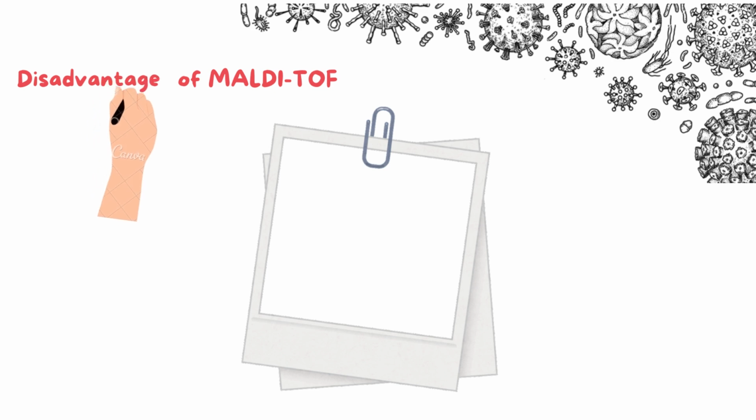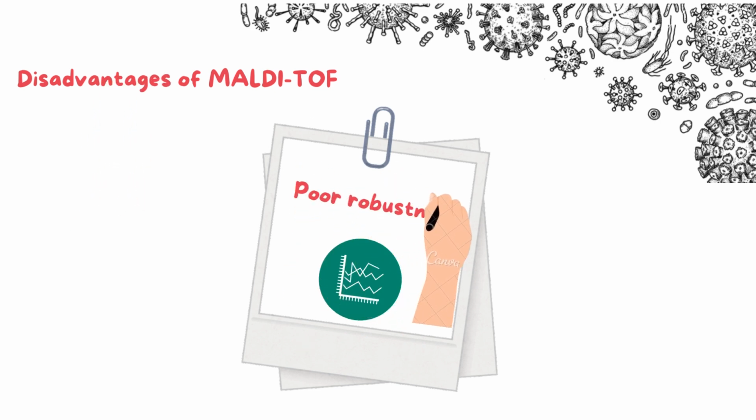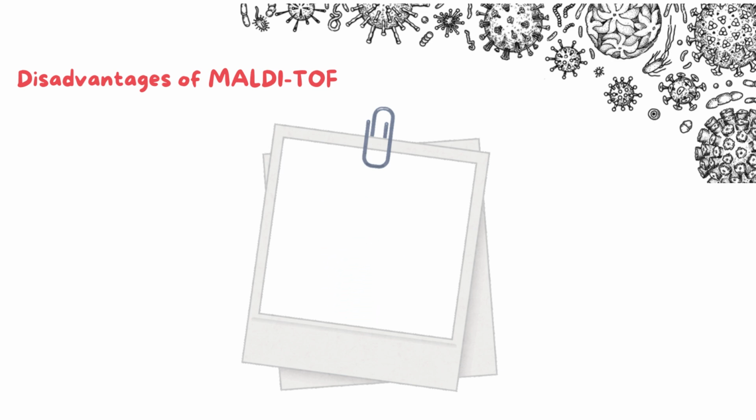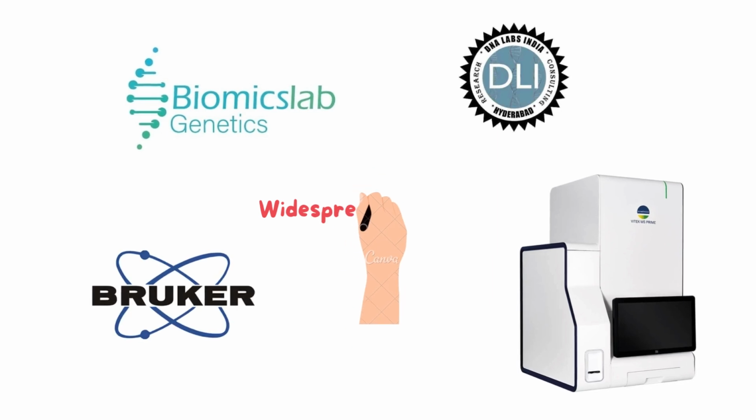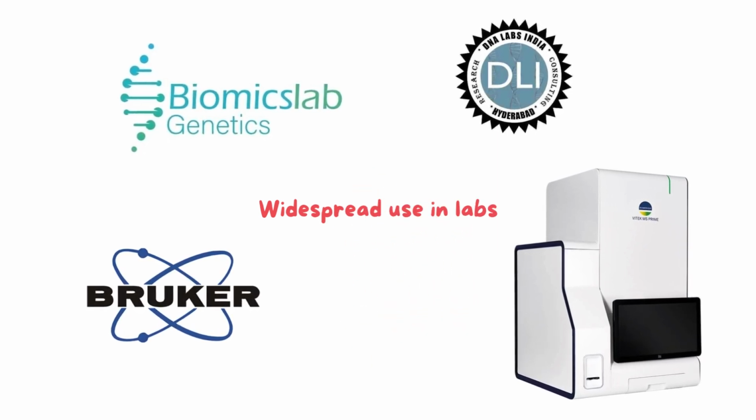However, like any technology, it has limitations. Some studies point to lower repeatability and reproducibility compared to other methods. Factors like sample preparation consistency can influence results. One key challenge is the formation of matrix-derived ions and their decomposition products. These create a non-specific chemical background that can mask or distort the true analyte signals, particularly in the low to intermediate mass range.